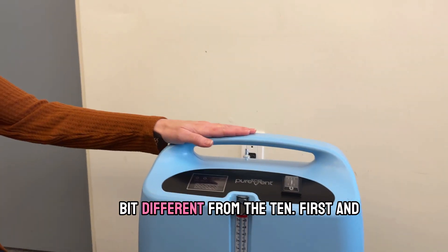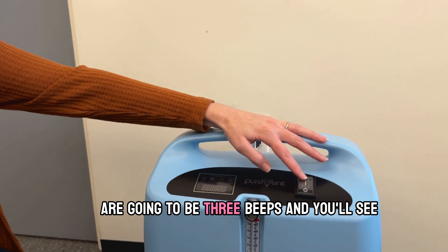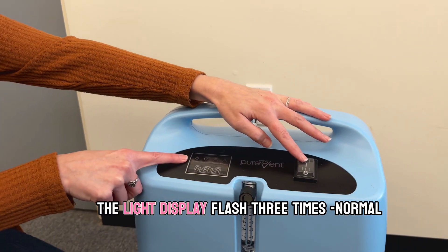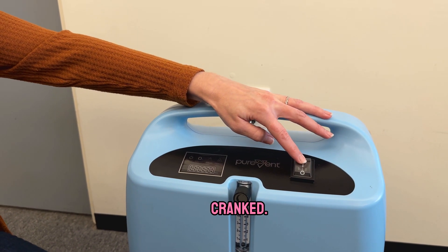This is our five liter unit, so a little bit different from the 10. First and foremost we're going to turn it on. There are going to be three beeps and you'll see the light display flash three times — normal startup. So we'll go ahead and get it cranked.